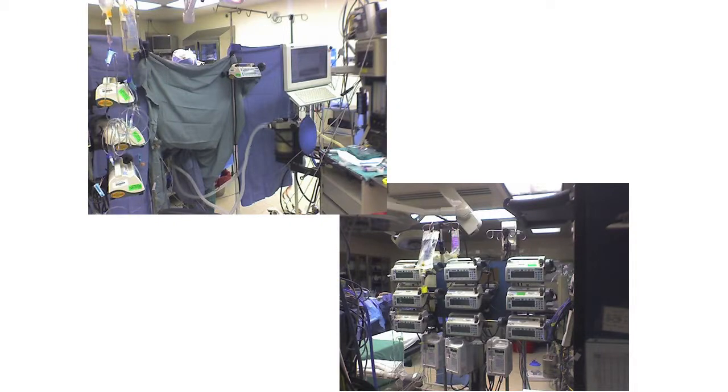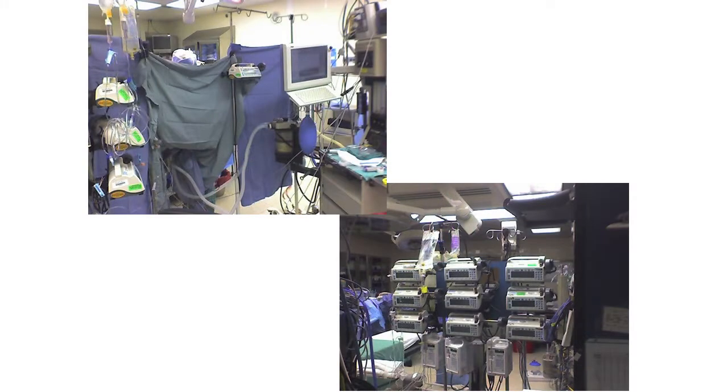Some other views. So you say, oh, but medical device vendors are selling us solutions. There's an enterprise solution. We now have data. We have information. The problem is they're proprietary. But if you look at these two pictures, these are infusion pumps for one patient. None of these pumps actually talk to each other, and there are three different vendors that sell these three infusion pumps, so there's no way that they're ever going to talk to each other in the current system.